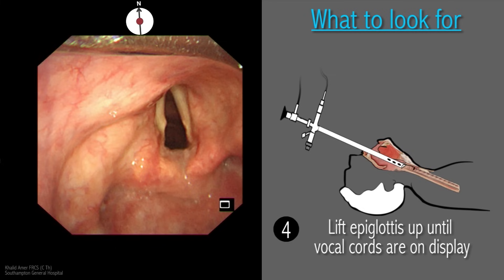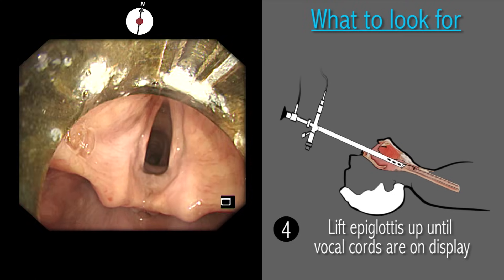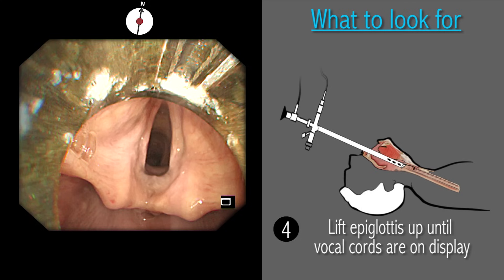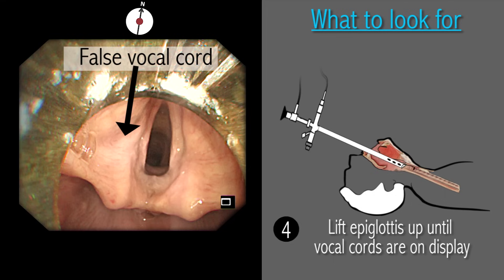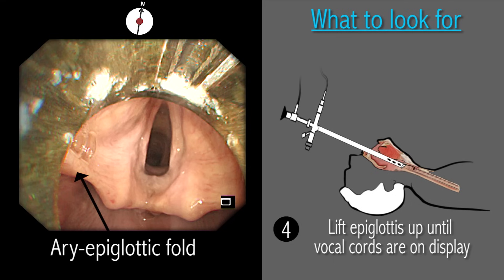To my mind, identifying and lifting the epiglottis is the main cause of failure to introduce the bronchoscope by interns and trainees. Once the epiglottis is lifted and the scope is advanced a couple of millimeters, the vocal cords should come into view. The operator should make note of any abnormalities of the epiglottis, vocal cords and the larynx. These should be reported to the ear, nose and throat surgeons for advice or follow-up, preferably with a photo of the abnormality.